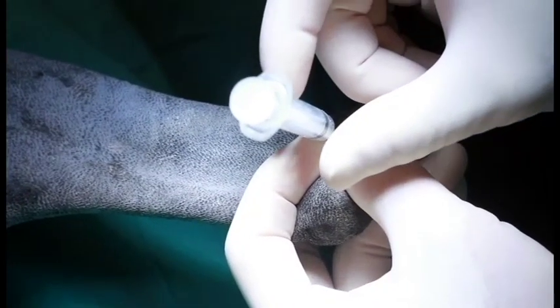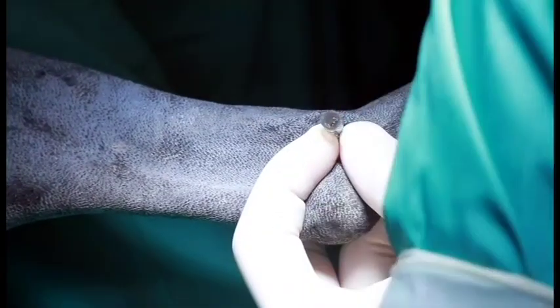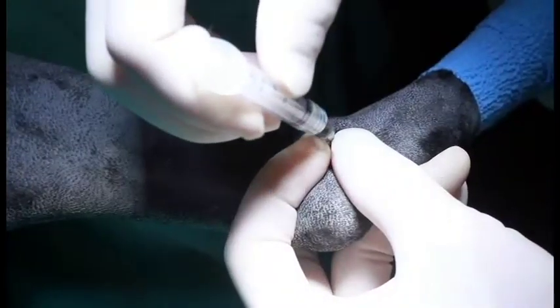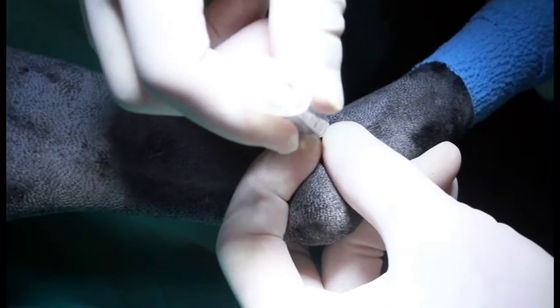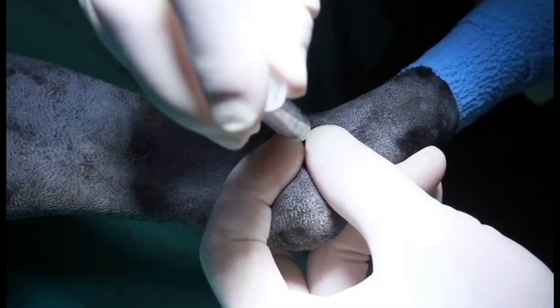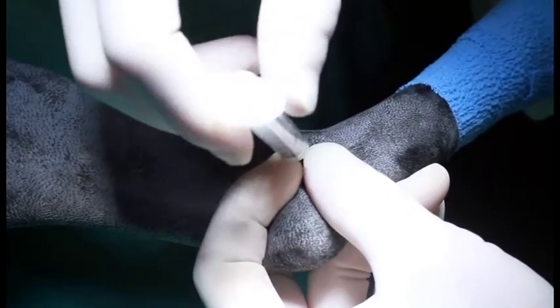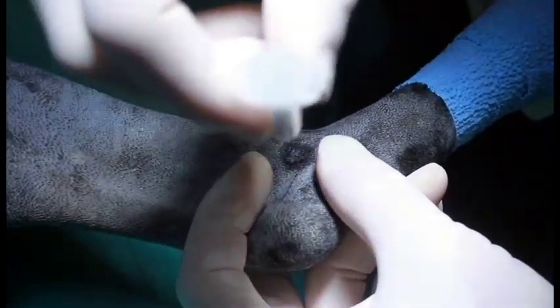For injection to the joint, simply remove the barrel of the syringe with the pre-placed needle. Attach your loaded syringe and slowly instill into the joint. Once you're through injecting, release pressure off the plunger and slowly remove your needle.